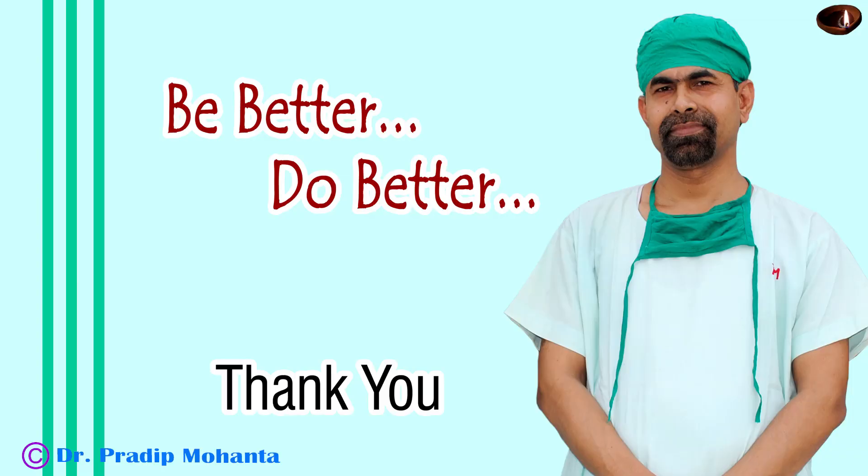Pure BSS remains at the conclusion of surgery. The anterior chamber is nicely formed and the case is concluded. Thank you very much for your attention. Hope this video will help you in developing your surgical skills. Be a great surgeon and serve your patients with love, respect, empathy and great surgical competence.